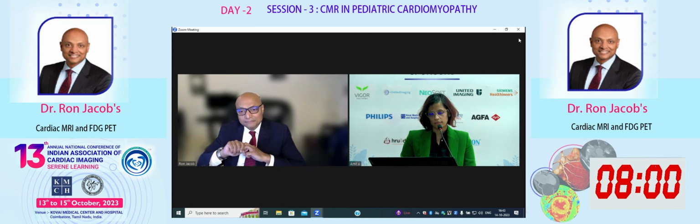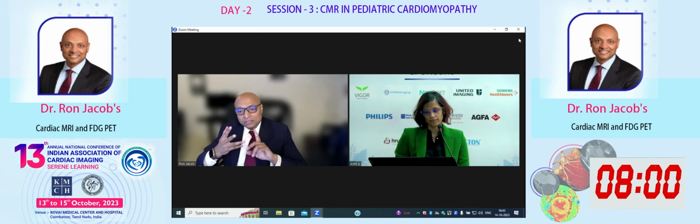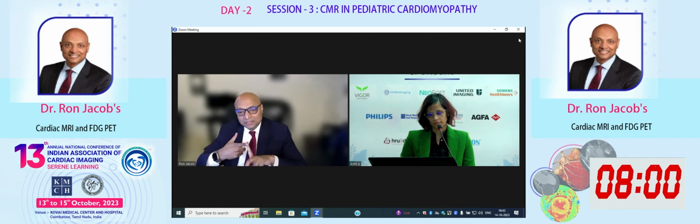The other piece of that is, if it's purely isolated cardiac, it is theoretically possible to have isolated cardiac sarcoid, but I would look at that very carefully, without any extracardiac uptake at all. So that's how I would approach that. We discuss all these patients in a multidisciplinary clinic. We have a rheumatologist, a pulmonologist, myself, a geneticist, and we put everything together. And sometimes you have to look at everything even without biopsy. You may decide to treat and see how they do with treatment, if it suppresses the activity. But I would look at that with a jaundiced eye.